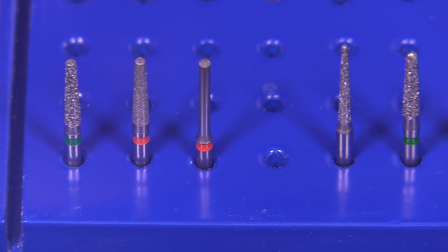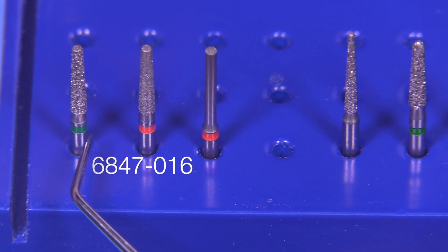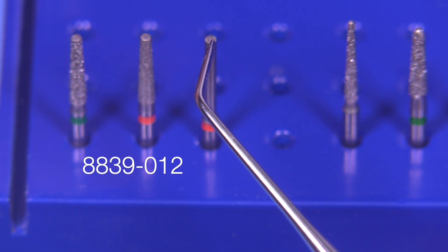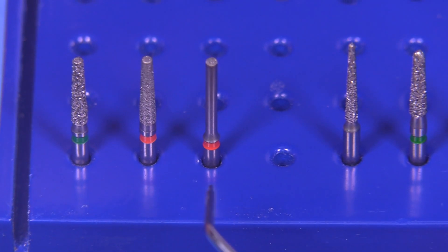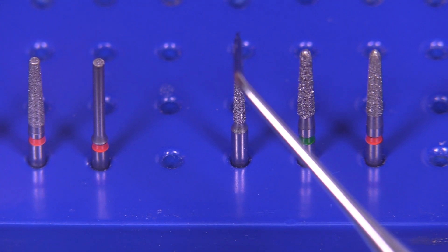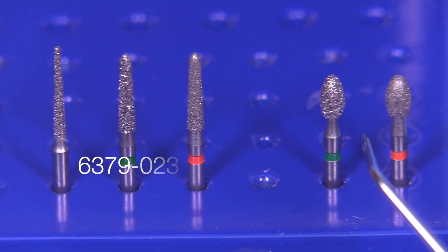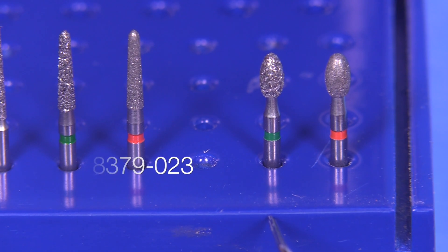The burs we're going to use are the ones used by many schools: the 6847-016, which is a coarse diamond, followed by the fine diamond 8847-016. The end cutting bur 8839-012, which is an optional bur. Then we have an interproximal bur, the 850-012. Then the chamfer burs, the 6878K and the 8878K. And then of course the footballs, the 6379 and 8379-023s.